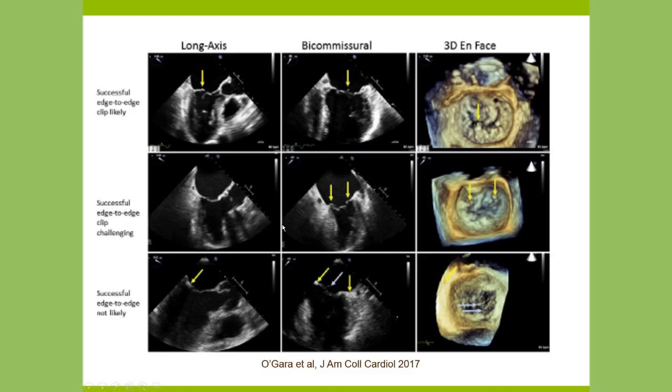This is something that's more challenging because this is one of my patients, actually, and he was 93 years old, but very active and quite symptomatic, and he had actually a flail P3 and a flail P1. And when you're working in the corners over here, there's a lot of cords that you can get tangled up in. So beginner MitraClip operators shouldn't be doing this one, but we got clips here and here in this patient. He's still alive and doing great, feels well. He's actually out putting fence posts in around his farm. So he's a tough 93-year-old guy.